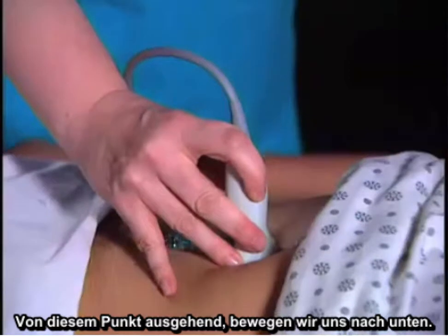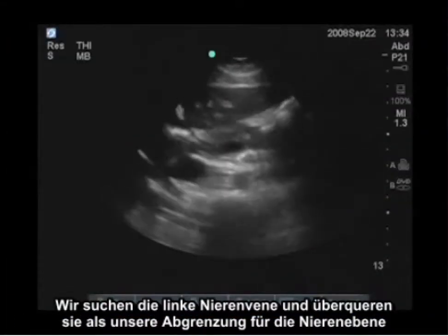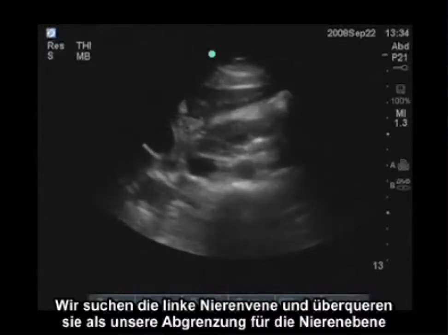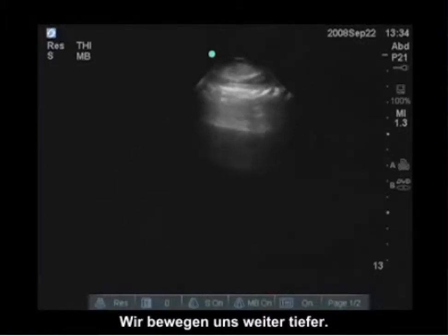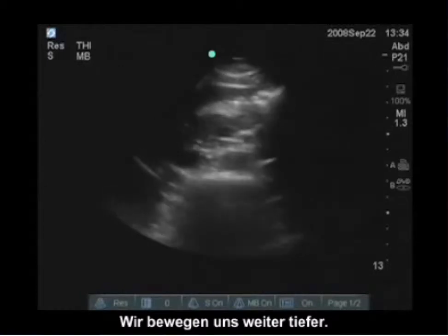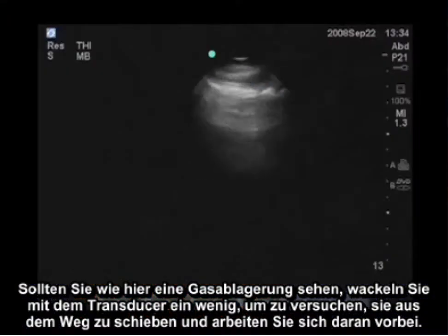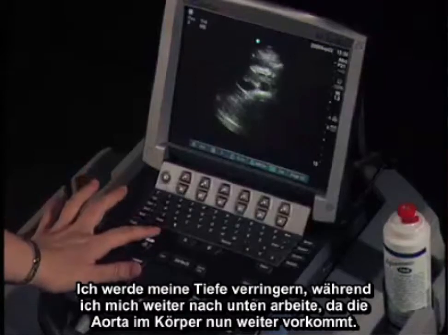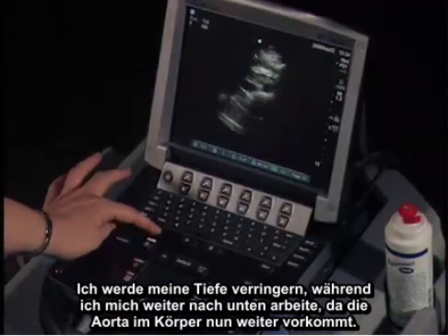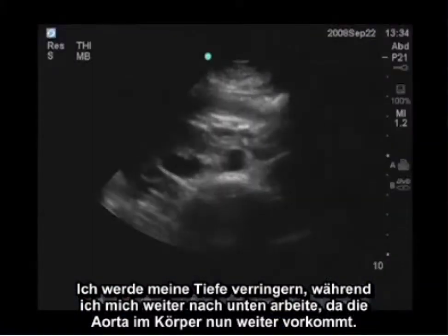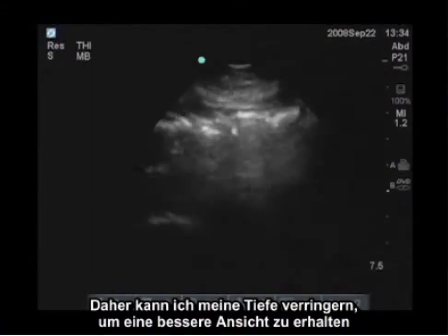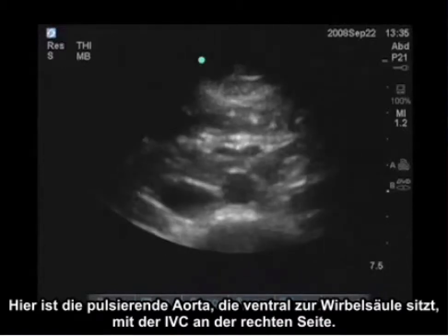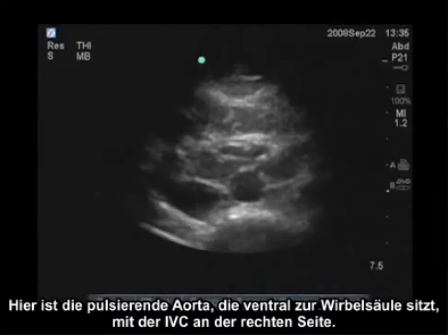From this point we're going to move down. We're looking for the left renal vein to cross over as our landmark for the renal level, and we're going to continue moving inferiorly. If you see bowel gas, just wiggle the transducer a little bit to push it out of the way and work around it. I'm going to decrease my depth as I move inferior, because the aorta is going to move anterior in the body. Here's the aorta pulsating just anterior to the spine with the IVC to the right.